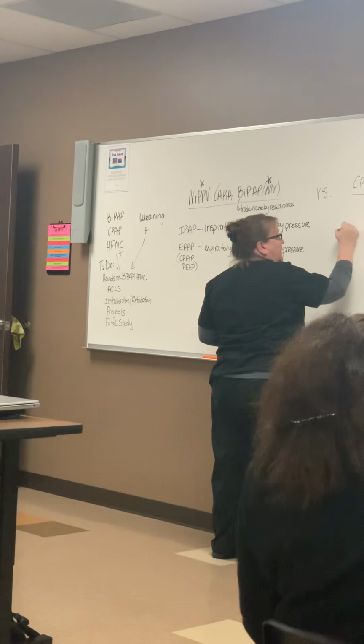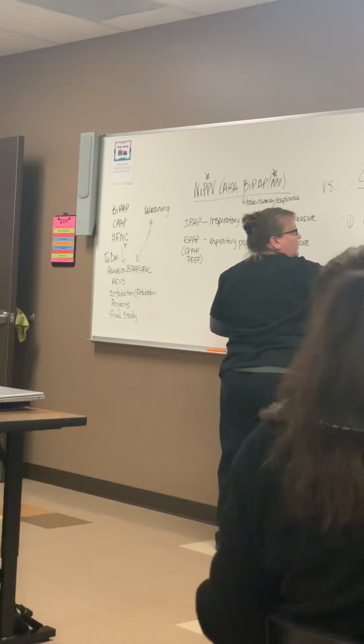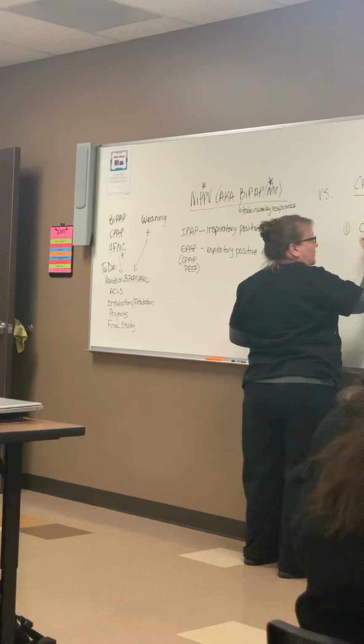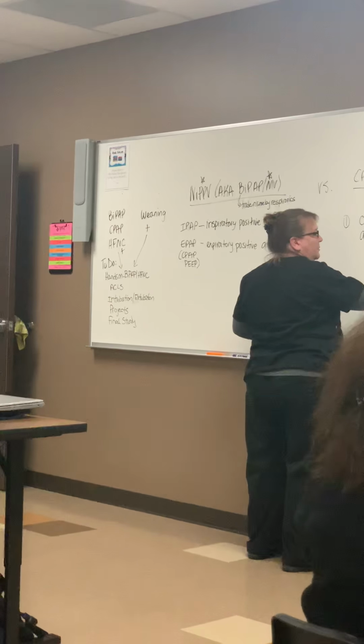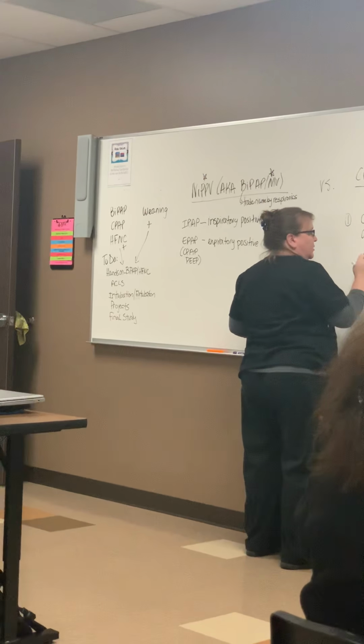CPAP is one pressure. It's continuous positive airway pressure. Oxygenation only.